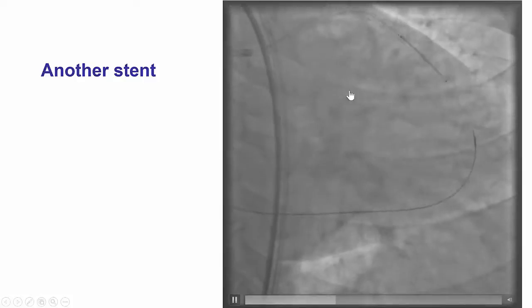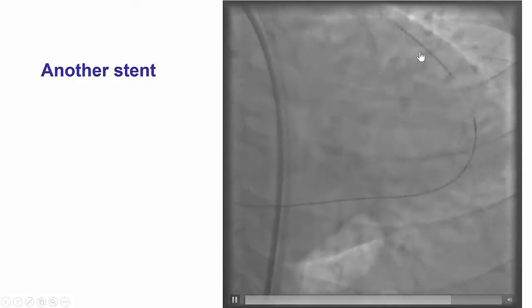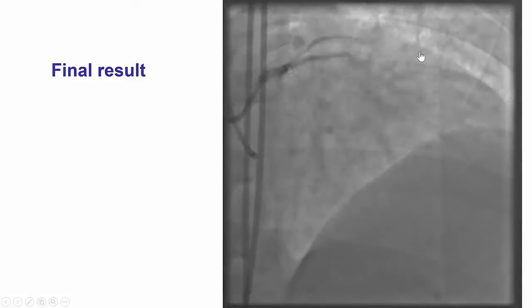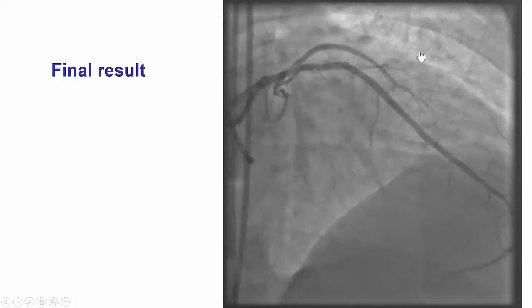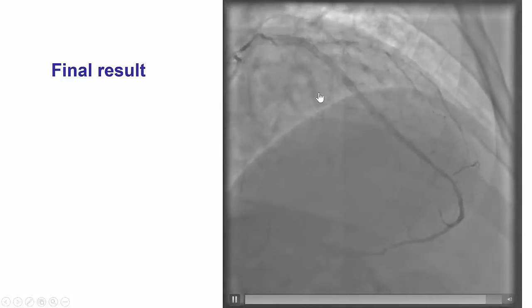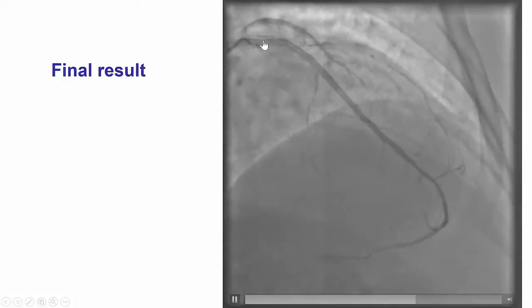As a result, we placed another stent distal to the previously placed stent. By doing that, we obtained a nice result, restoring antegrade TIMI 3 flow into the distal LAD.